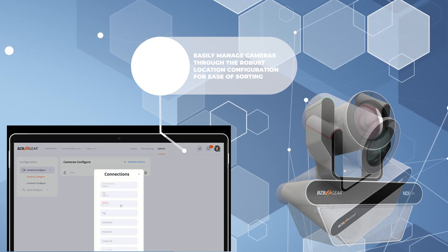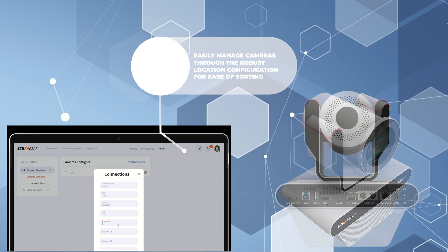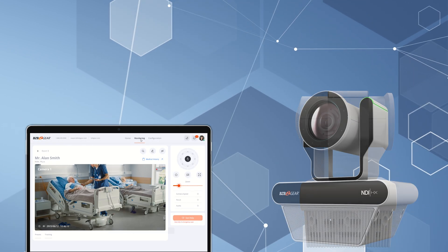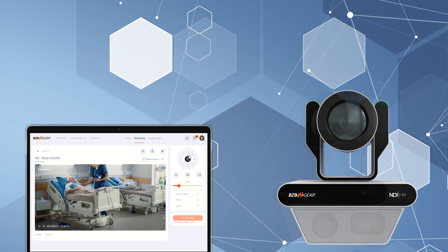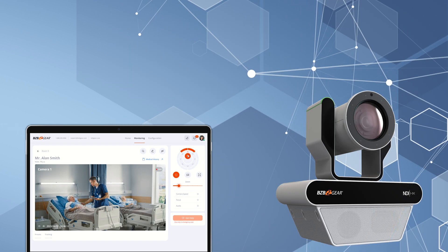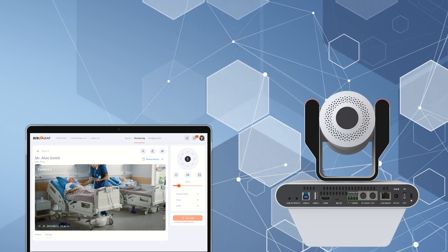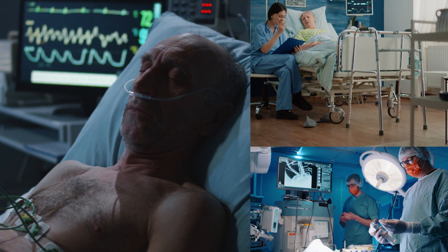Take full advantage of a robust suite of controls software for the Nutrix, making the experience of patient monitoring and telehealth care as simple and easy as possible. From patient rooms to operating theaters, the BG Nutrix is the perfect ally for medical professionals, ensuring exceptional care and monitoring.